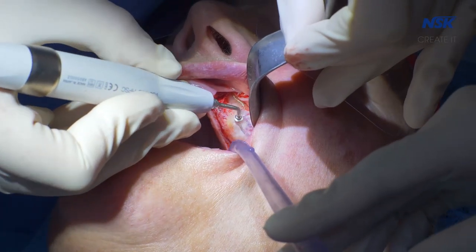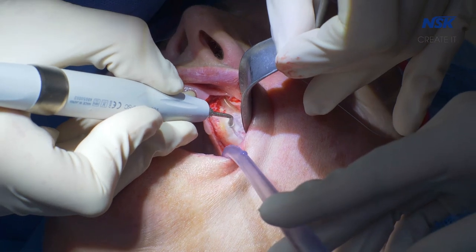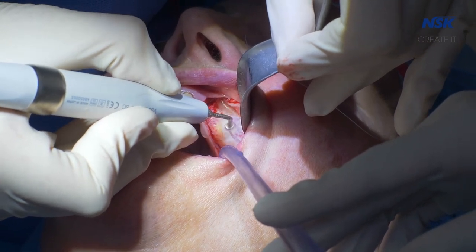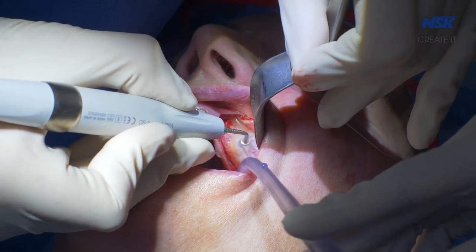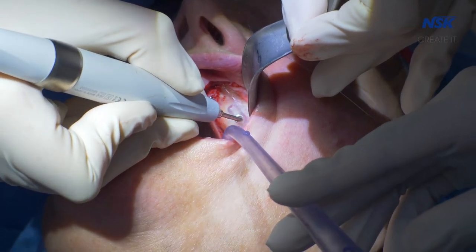When I did my first course in sinus augmentation in Los Angeles, the Variosurg was the unit presented for the course. When I went back to the surgery in Australia, we had a different piezo and I used that for a bit, but it didn't seem to have the same amount of power and wasn't as slick in the setup. When I had the opportunity to purchase my own piezo, I already had the Surgery Pro, and the two units combine very nicely — just one foot pedal. The handpiece holds the range of tips very well. It's a solid bit of kit.